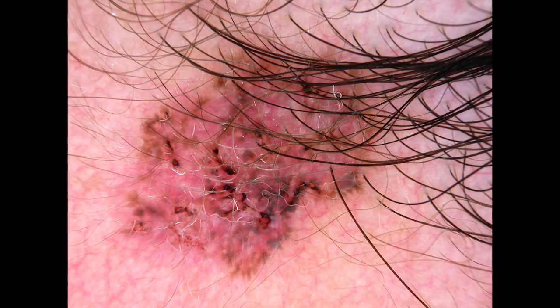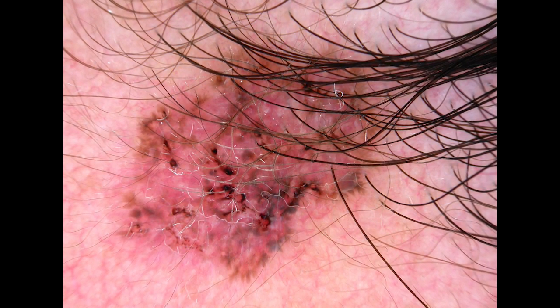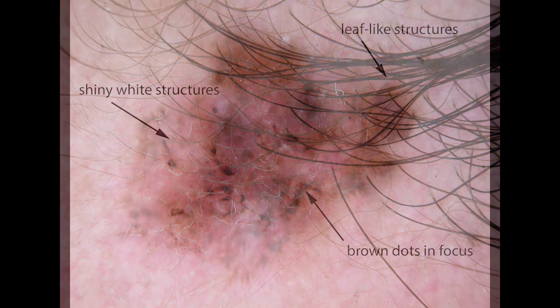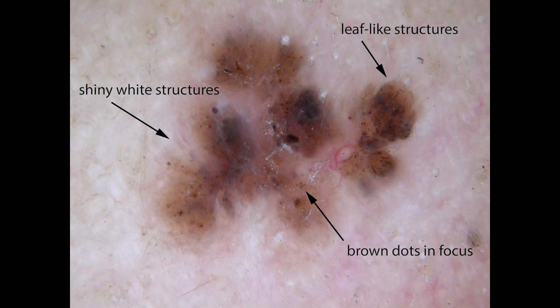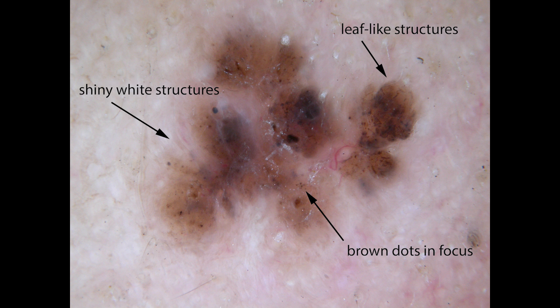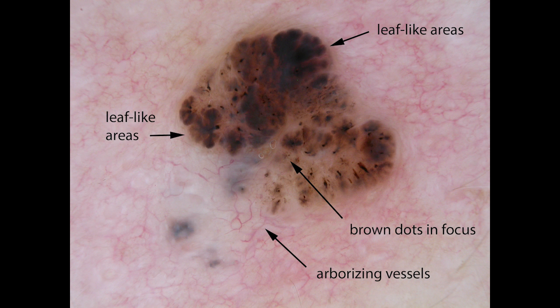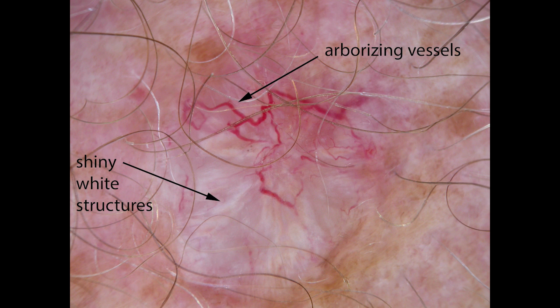Here are some examples of basal cell carcinomas seen through a dermatoscope. In this basal cell carcinoma, you can see leaf-like structures, brown dots in focus, and shiny white structures. This basal cell carcinoma also has leaf-like areas, brown dots in focus, along with arborizing vessels. This is a typical nodular basal cell carcinoma with arborizing vessels and shiny white structures.